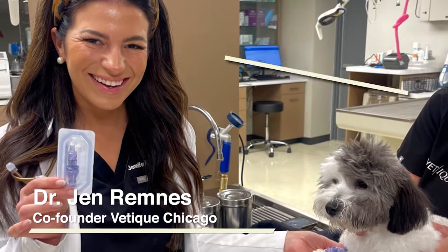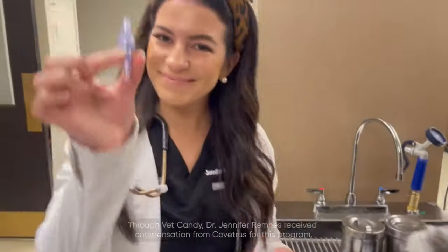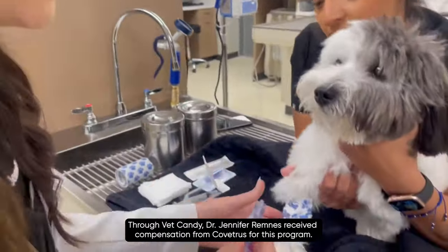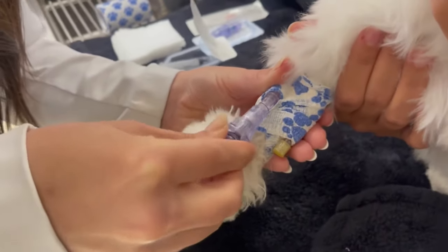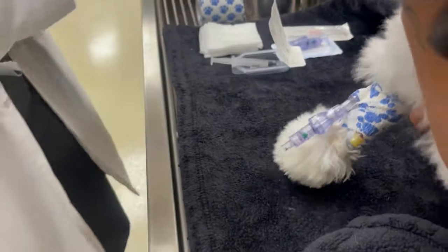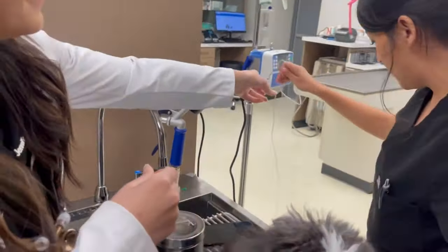Hi guys! Introducing the Covetrus Break-Free Breakaway IV Connector. The Break-Free Vascular IV Set is a cutting-edge medical device that separates when harmful force is exerted across the IV line. This innovative design eliminates the risk of dislodgements and breakages, providing unparalleled safety and reliability during IV therapy for animals.